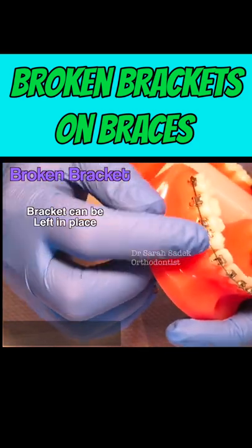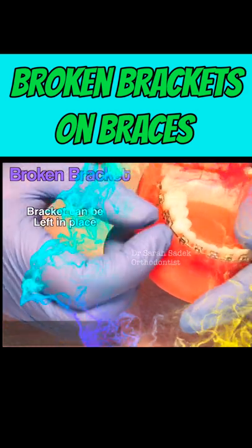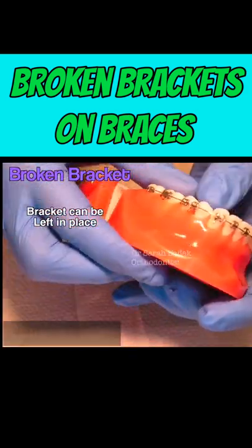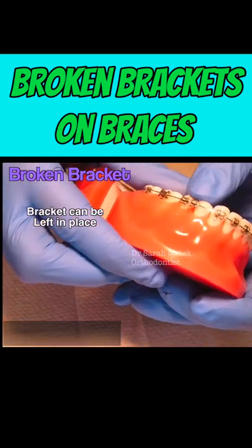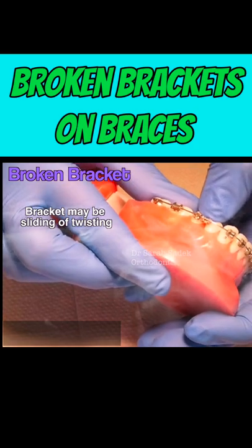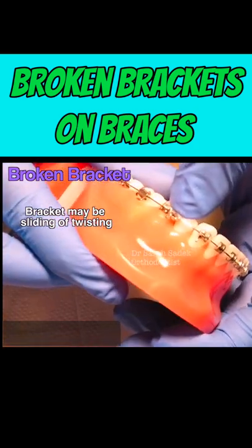If your bracket is broken and still attached to the wire, you can leave it in place. You may notice that the bracket is sliding along the wire. The bracket may also have twisted on the wire and it may be digging into your cheek or lip.